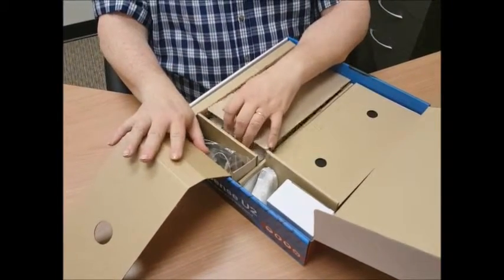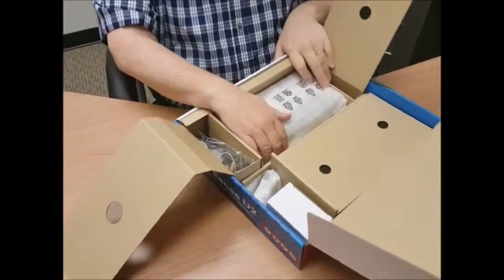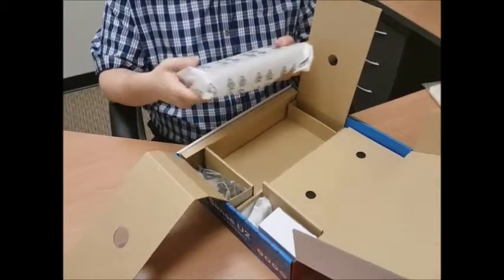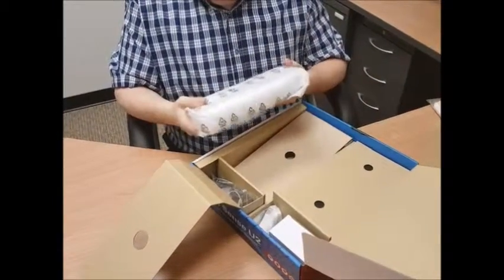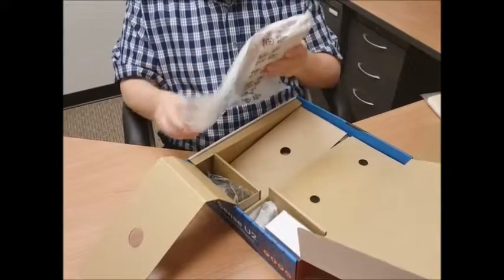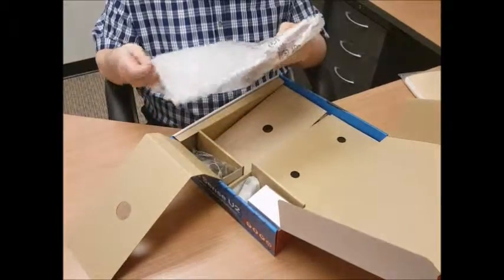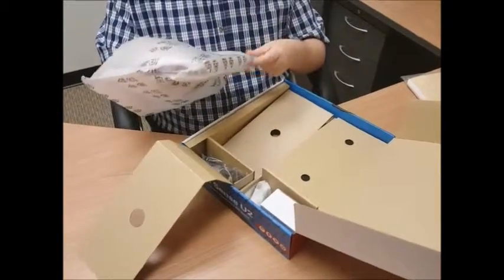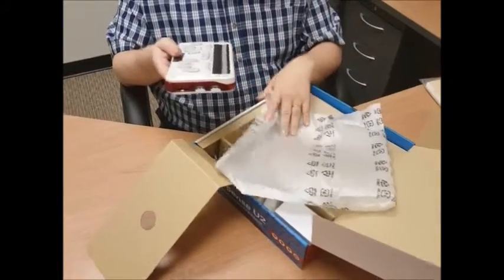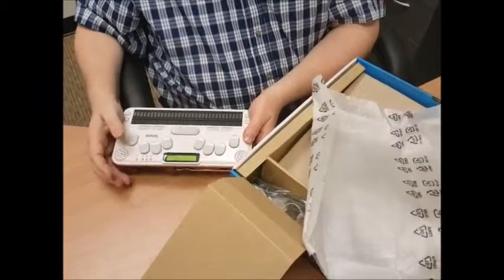Leaving the right side folded over, I'm going to undo the left side, and now in another little packing bag we have our BrailleSense U2 that I'm lifting out now. All nice and neat. Here we go — here we have one BrailleSense U2 right out of the box. So that's what you will find in your box when you first get your BrailleSense U2.